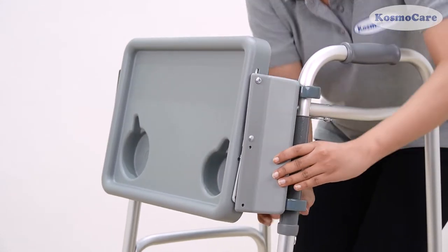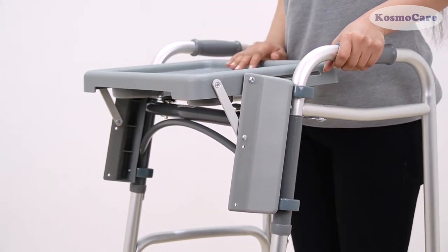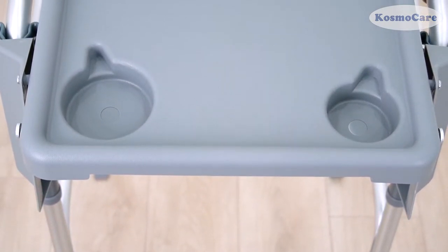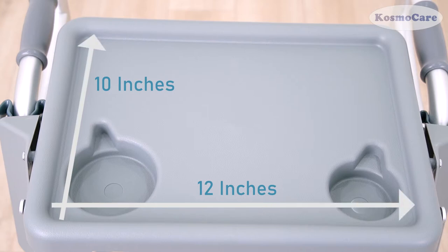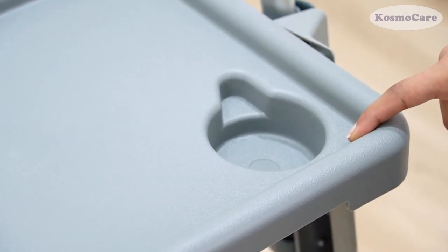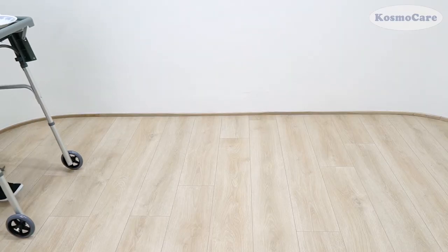The tray easily slides up for use and locks to stay in place. Its table top surface is 12 inches wide by 10 inches deep, giving you more space to carry your daily utility items. The tray also has a half-inch raised border to help prevent items from sliding off while using the walker.